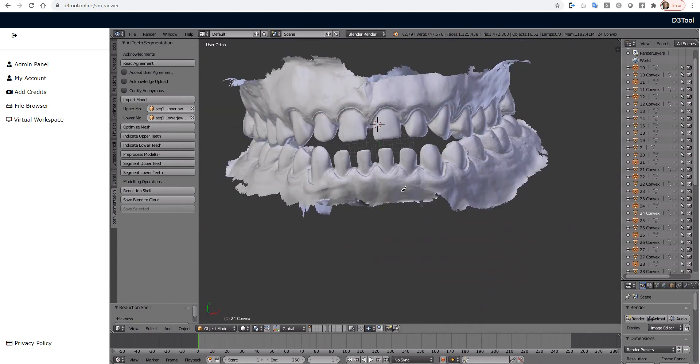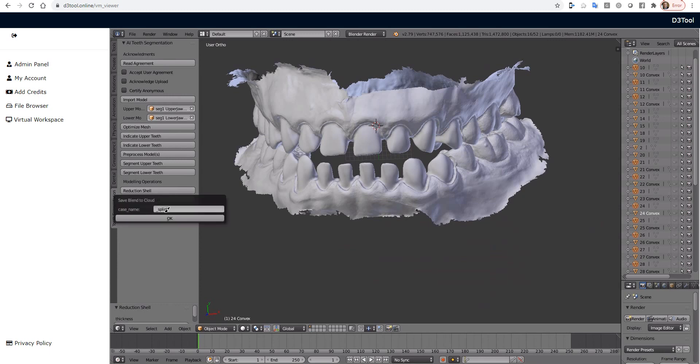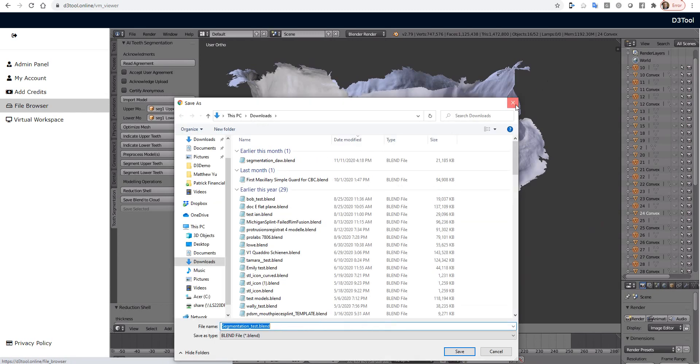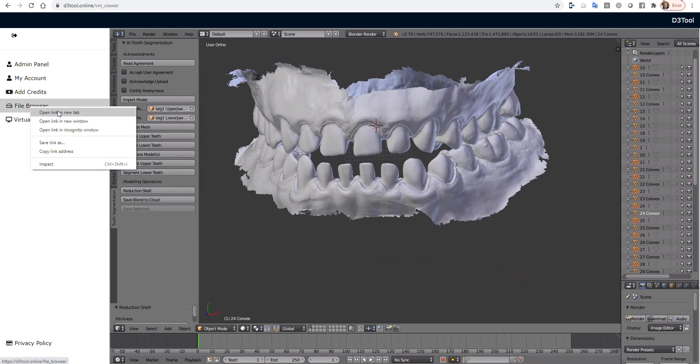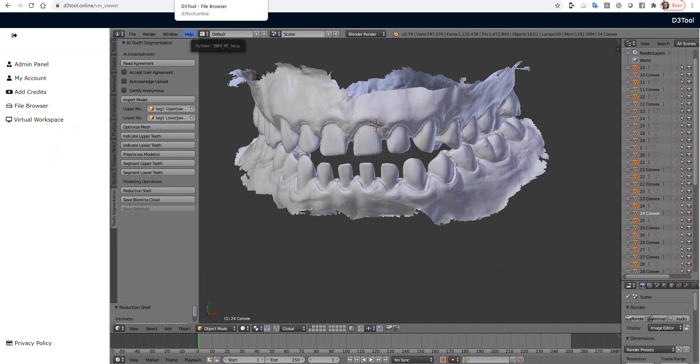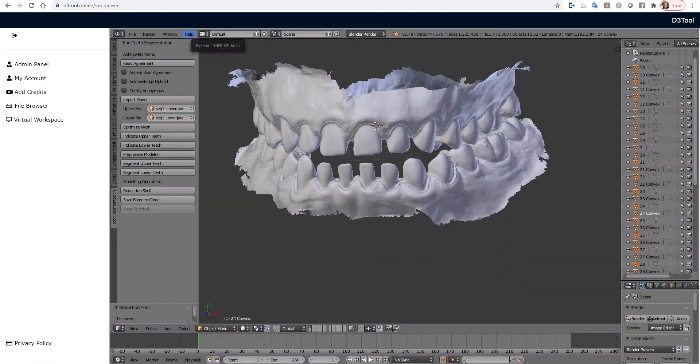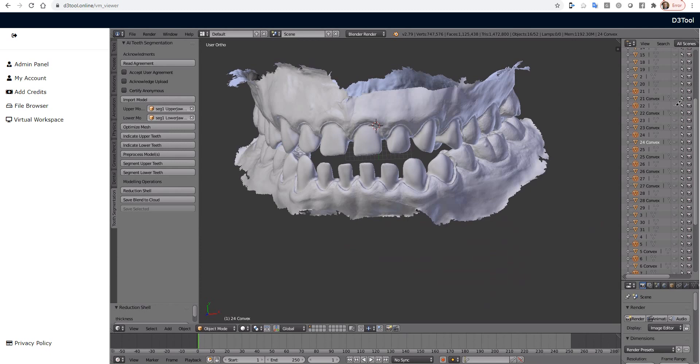So now that we have this, we can then save this blend file. So if I press Save Blend File to Cloud, name it Segmentation Test, it will later appear over here in our file browser, and we'll also get a popup to actually download it. But if we come over here and open this up, you can see the file in your file browser right here. And then you can download it anytime you want later on. Okay, so that's the whole project file that will have all the individual segmented teeth, and also all the solid teeth.